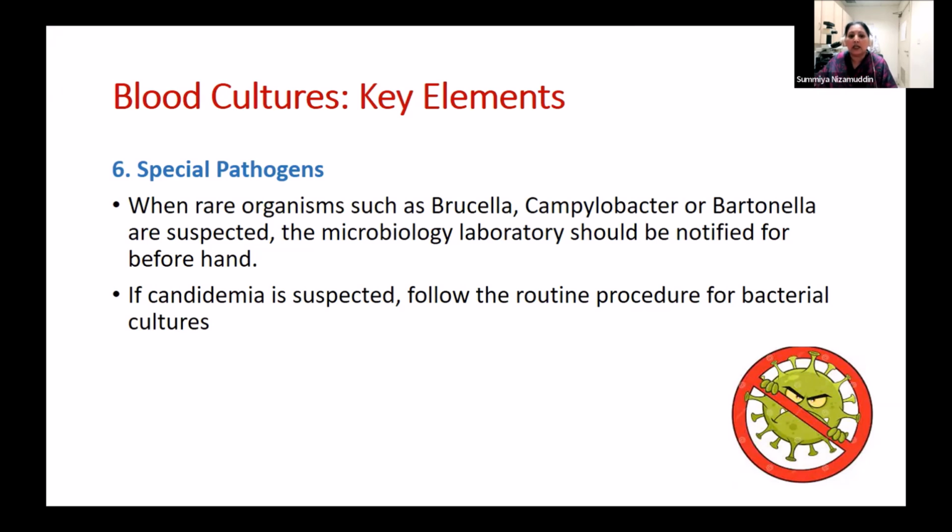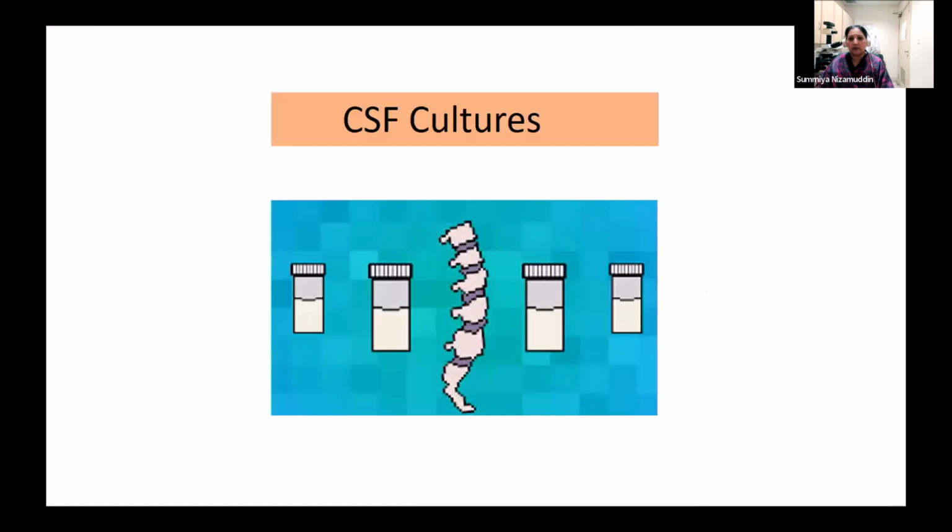So we have to ensure that these samples are properly handled. So it's always helpful if we know this beforehand कि ये suspected infection था यहाँ पे, ताकि उस sample की handling और फिर जब cultures positive आएंगे तो उसकी handling वैसे ही हो. If you're suspecting candidemia, इसमें same procedure follow करना है. कोई procedure का फर्क नहीं है, but just let the lab know that you're suspecting candidemia, because in that case we would be holding the bottles for longer.